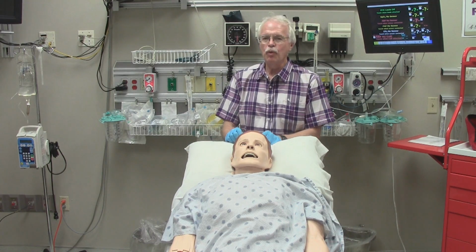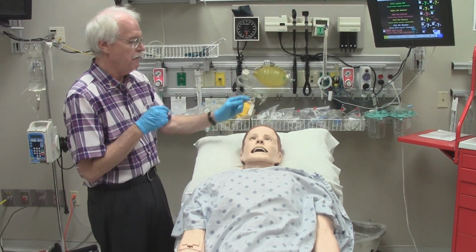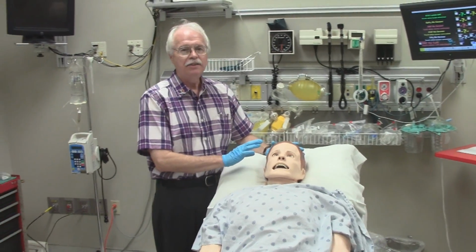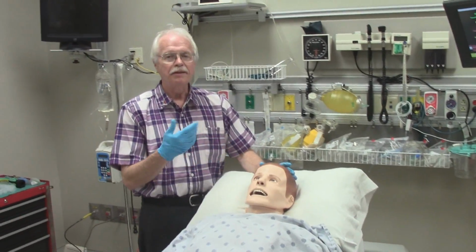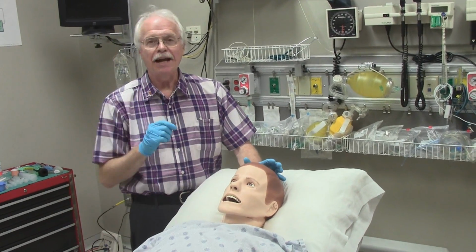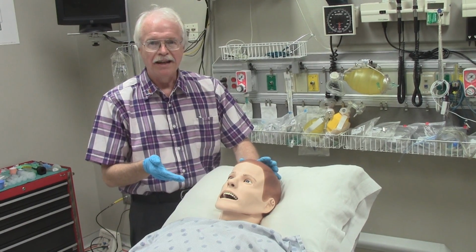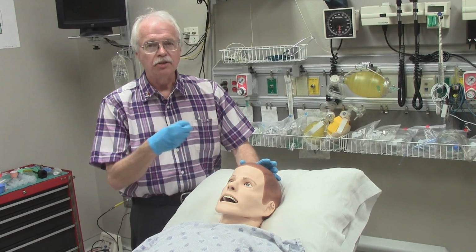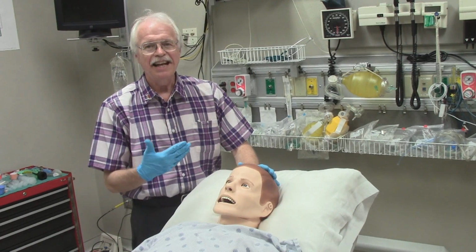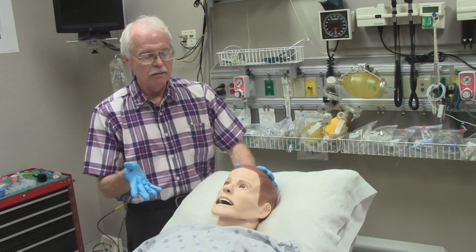Now, a few quick comments about the SimMan Essential simulator and his features. Working from the top down, he has a speaker in his head. That speaker is connected to a microphone in the control room down the hallway. As the instructor watches you using the ceiling cameras and listens using the microphones that are located both on the ceiling of the room and on the simulator, he or she will be talking through the microphone or through the speaker in the mannequin to simulate the patient's voice. Try to think of the patient as being real, interact with the patient as if they were an actual patient. After a few minutes, it will become real to you.